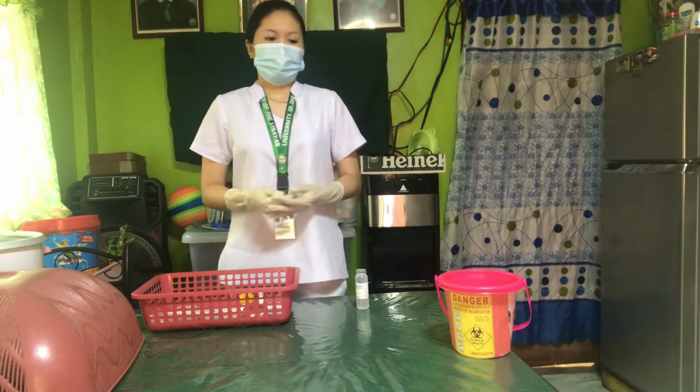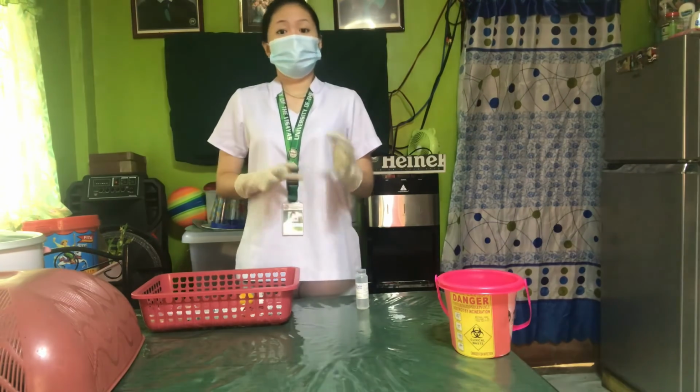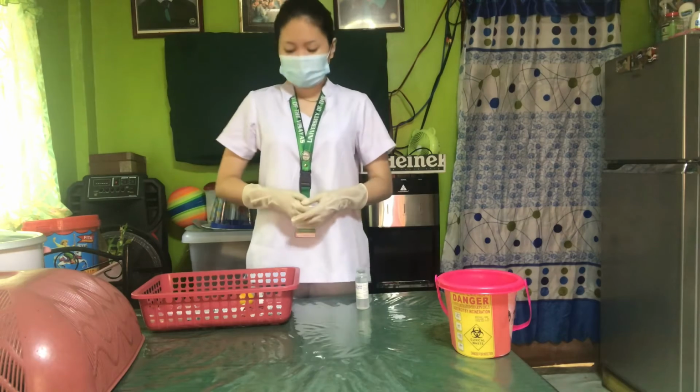Next is attach the filter needle to draw up premixed liquid medication from multi-dose vials.